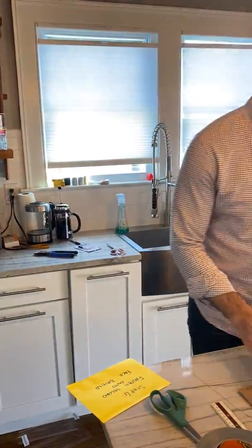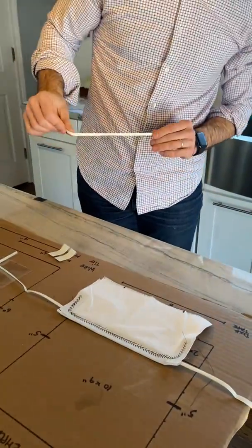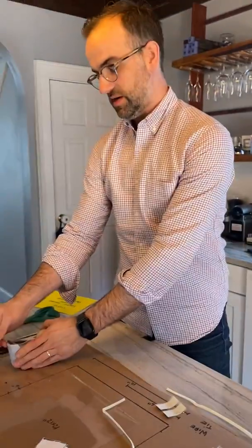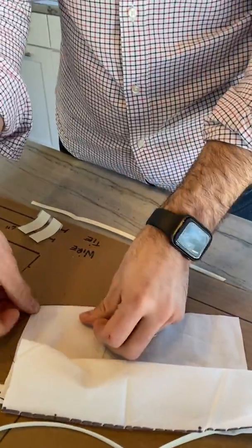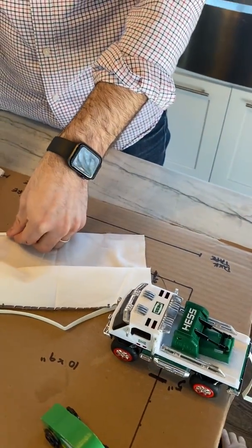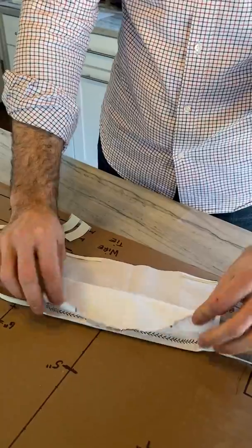Step five is sew the lower mask. For the lower mask we put a little two-sided tape on the lower corners, which is why we marked them earlier, and we position these and just fold this right over and then come back to our sewing machine.